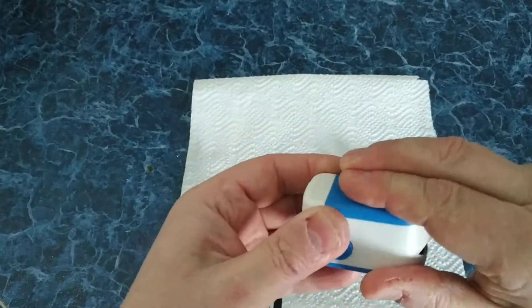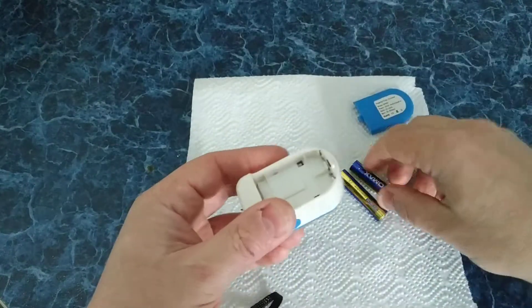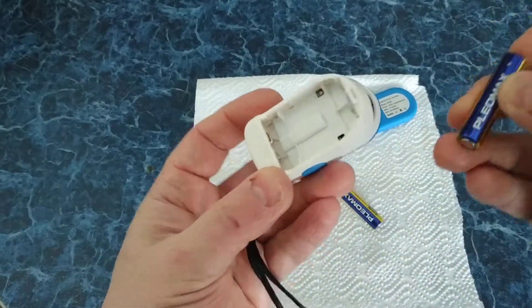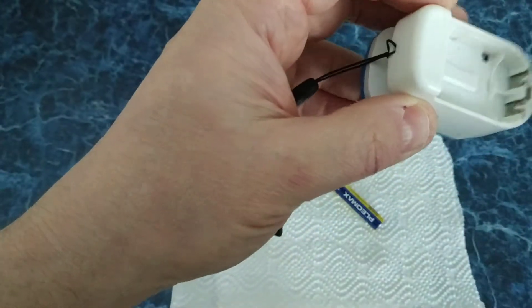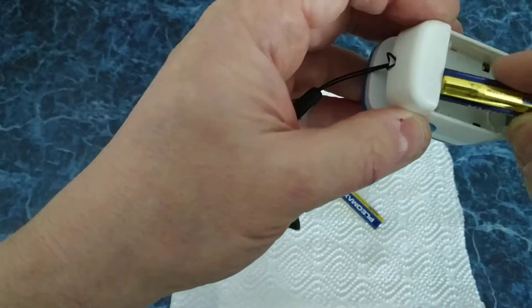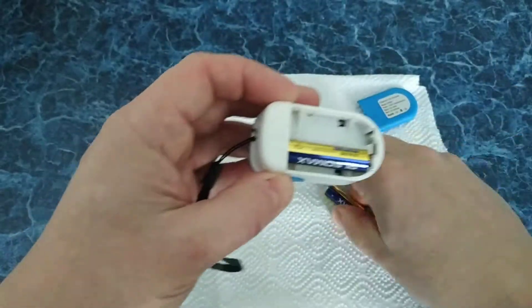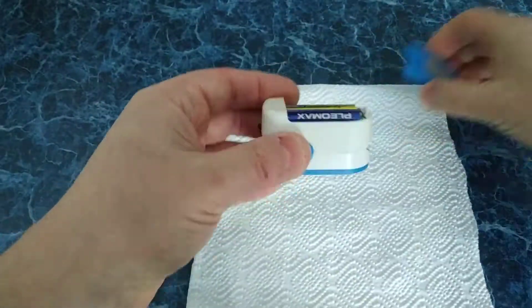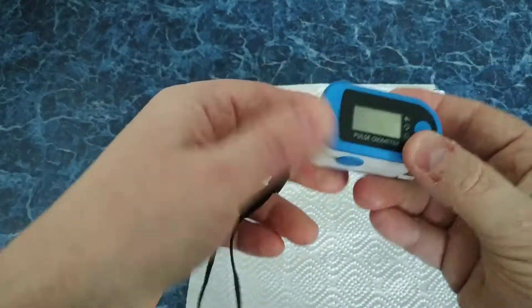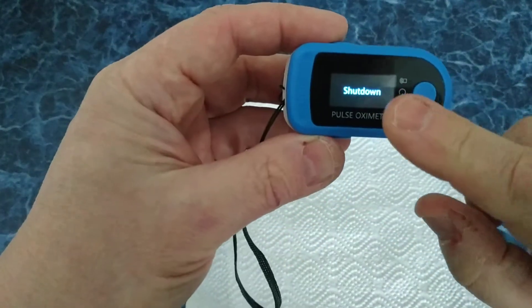First, we should put two 3A batteries. To look for polarity, it should go plus here, minus here, and the next one is plus here, minus here. Okay. Currently it shows that it works.